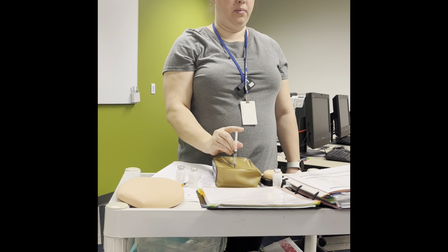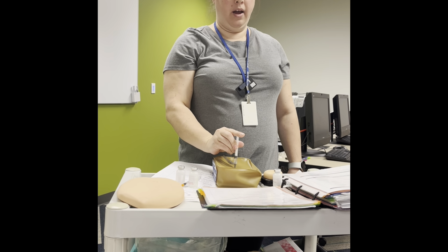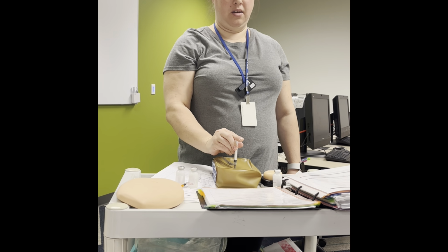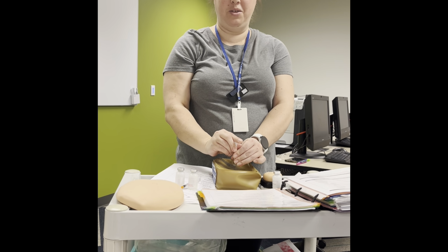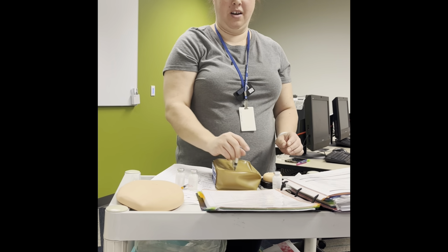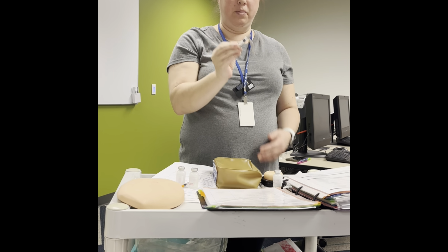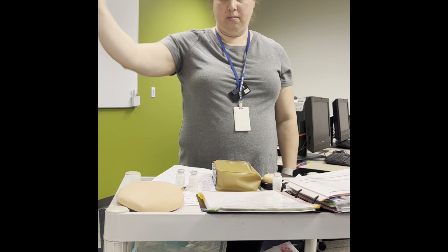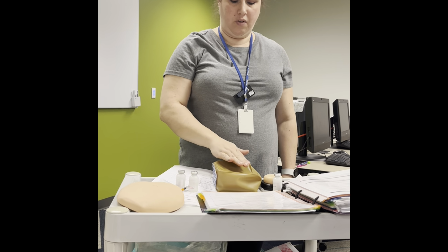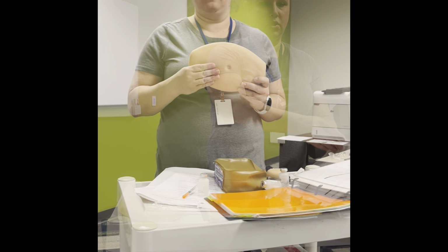Hold onto the top with your pointer and push the medication in slowly at a rate of 1 ml per 10 seconds. Wait 10 seconds. If you need to, because you're nervous, stabilize it with your other hand, because we don't want it moving all around. We're gonna pick it back up. Don't massage it. Activate your safety. Place in the sharps container. Give our patient a bandage. And then we're gonna move on to the next one.